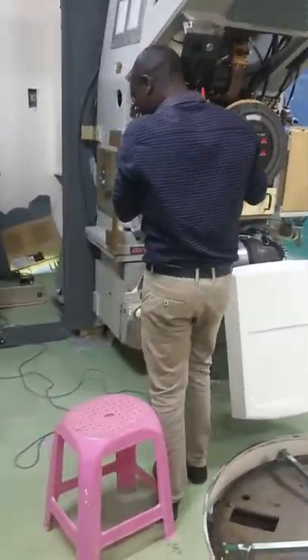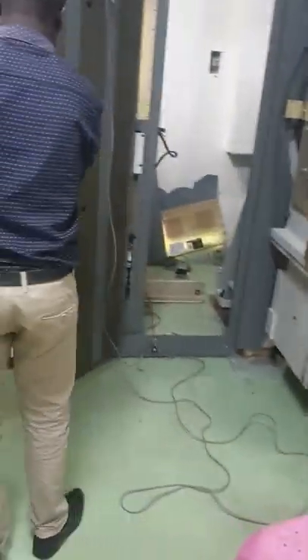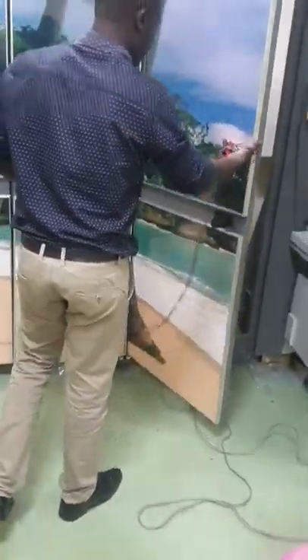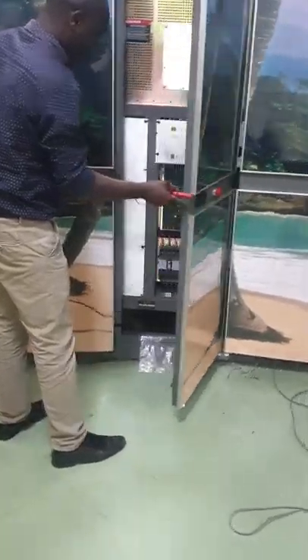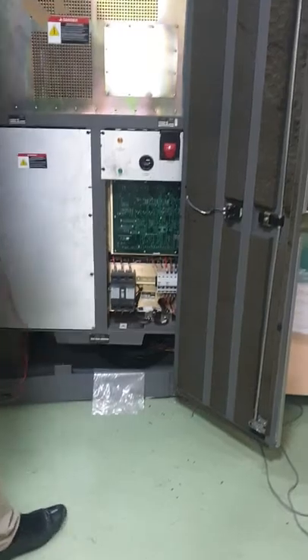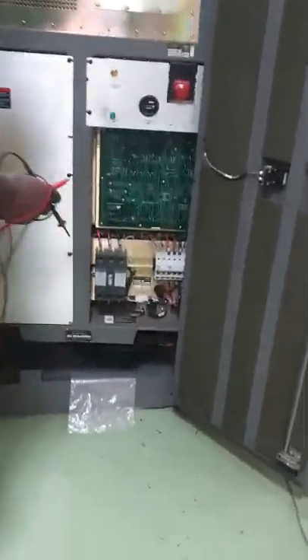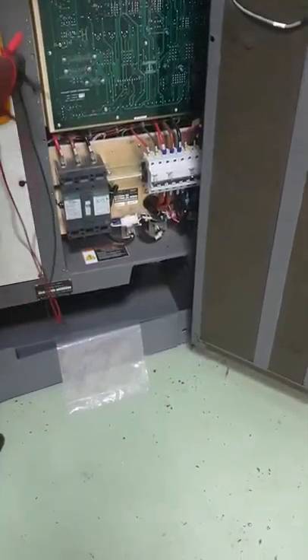He is now through with that one — it's okay. Now he is headed to the modulator power supply section. This is where all the power to the machine emanates from. You can see we have circuit breakers there. He is confirming if the three-phase power supply is okay.